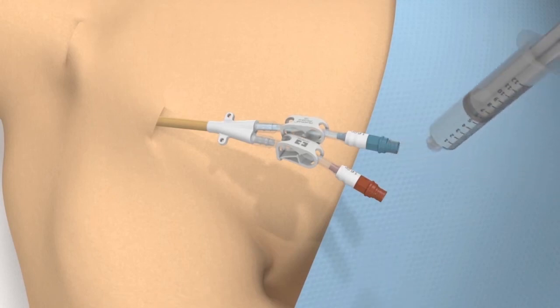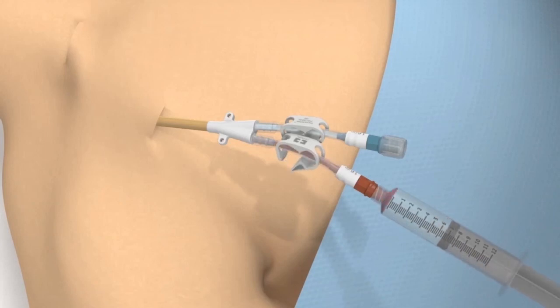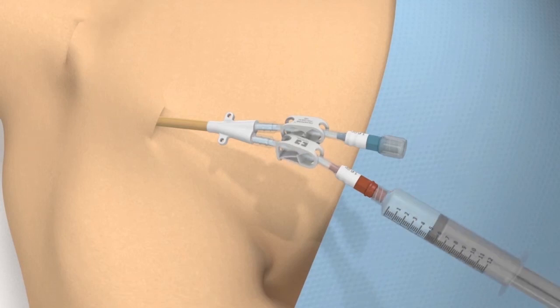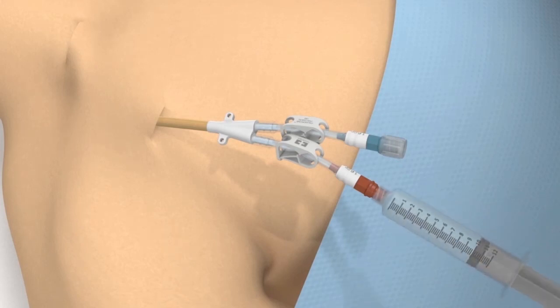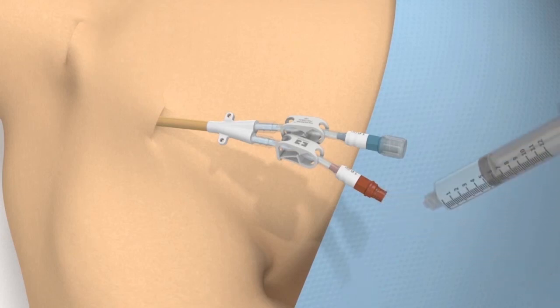Follow with a heparinized saline lock of 5,000 units per milliliter or according to institutional protocol. Note the priming volumes are printed on the sleeves of each lumen. Clamp the extensions immediately after infusing, utilizing the positive pressure technique. Place a small amount of heparin in each of the sterile injection caps and attach the sterile injection caps to each adapter.